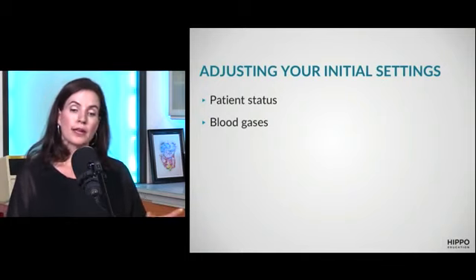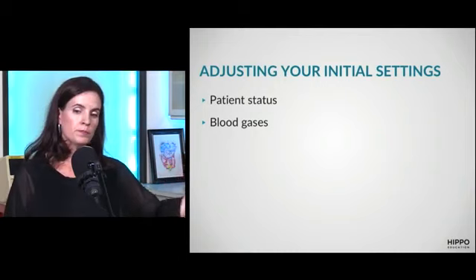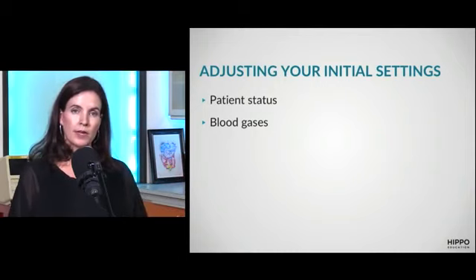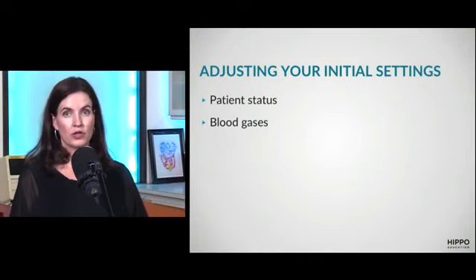And then you're getting blood gases. Usually I'll get my first set maybe 15 minutes after I've intubated. And then, depending on how sick the patient is, maybe every hour or two after that to continue adjusting as the patient changes. And so when we look at common problems that lead us to adjust, we need to know what changes to make on the ventilator for these problems.